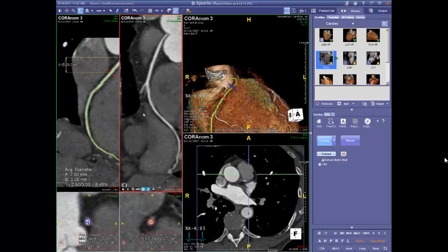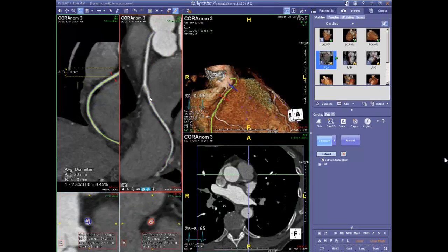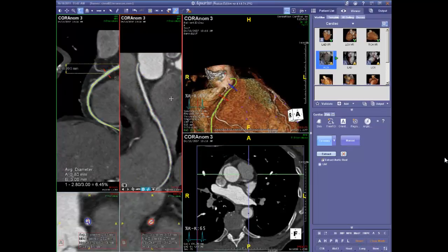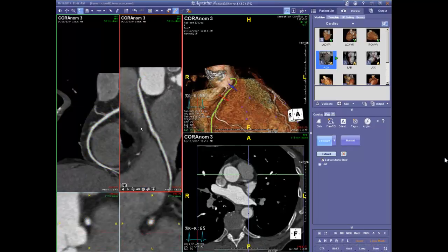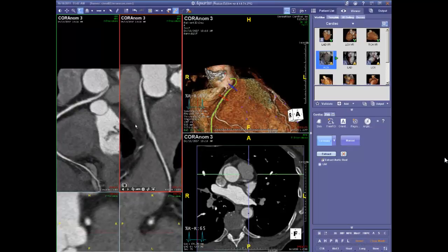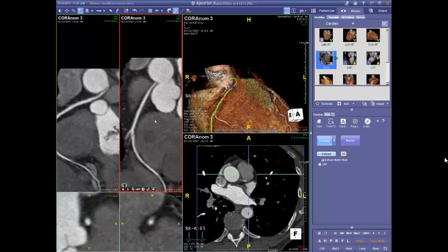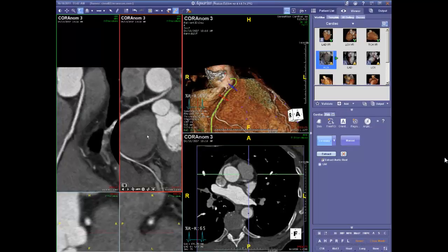Going back to the curved planar reformations, the software tools were pretty successful in recognizing this. Let's see how they render the orifice - I'll twist around and take these masks off. We really don't see any atherosclerosis; we see an area of motion artifact which you'll come to recognize quickly. The right coronary artery is a dominant vessel here, and you can see this very oblique takeoff - there's a high likelihood that part of this vessel is traveling within the aortic wall itself. This is exactly the lesion that was described.